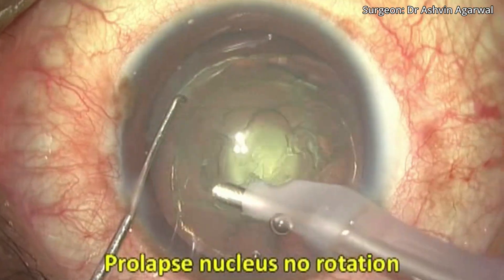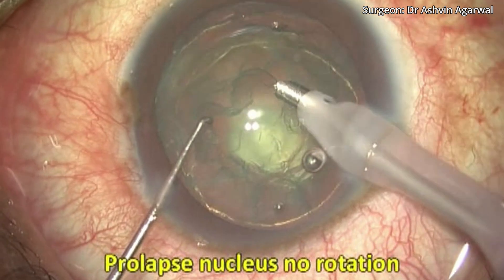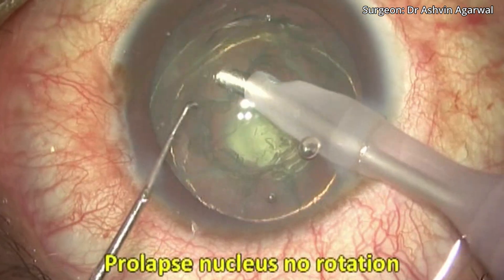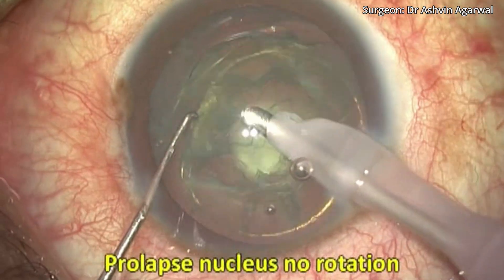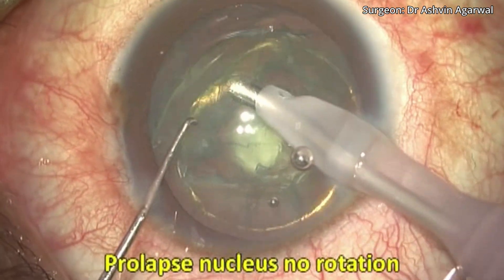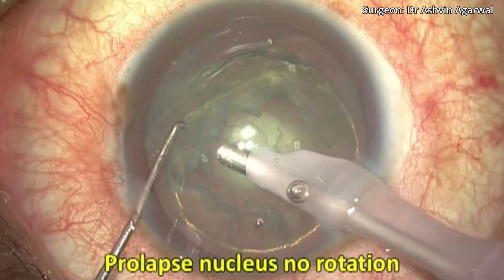Remember, nucleus rotation is contraindicated in a case of PPC because this increases the chances of a posterior capsular rupture and zonular dialysis.